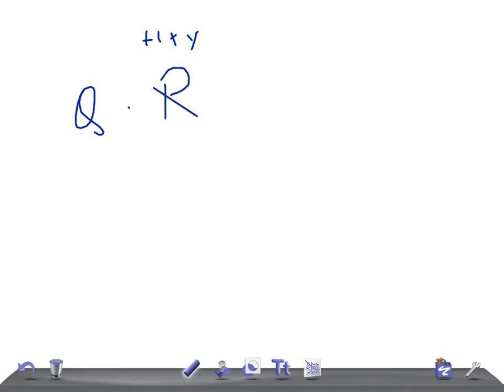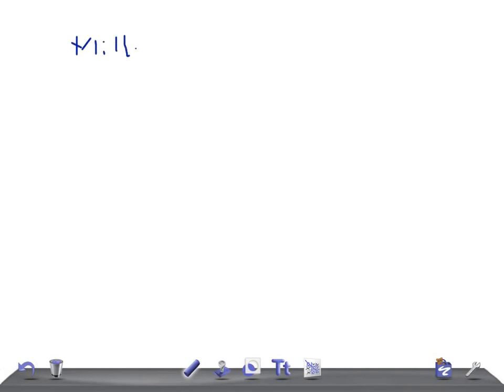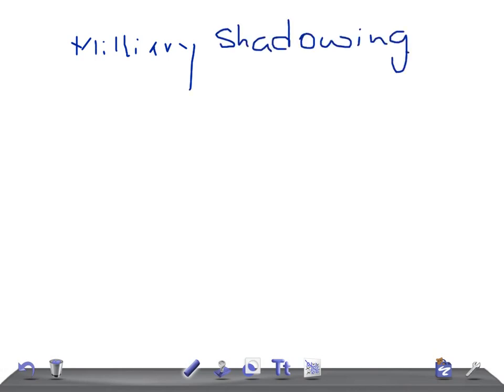Welcome to Quick Radiology. Today I'm going to talk about miliary shadowing on X-ray — what are the causes? Let's start. Most important is tuberculosis, very important.